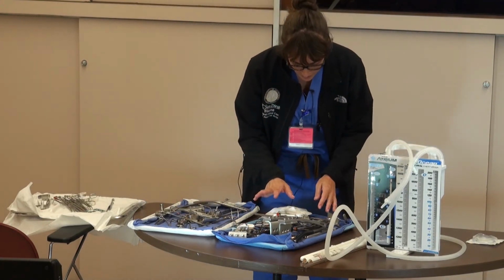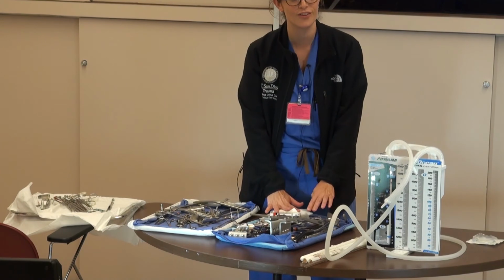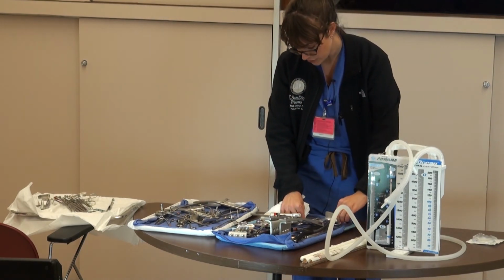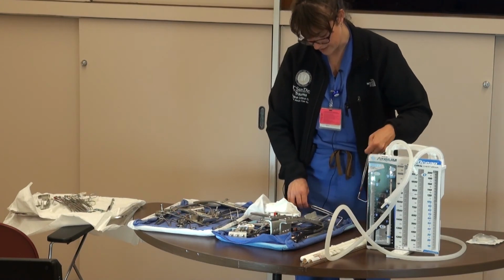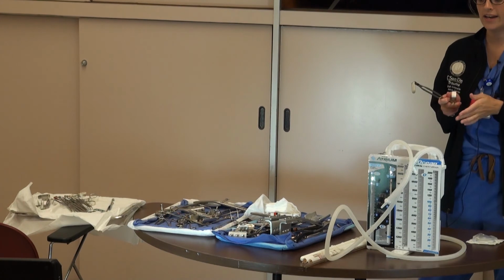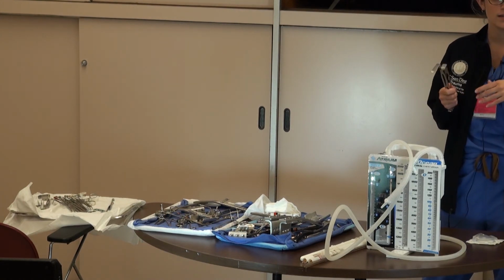So now I've looked at a few of these chest trays, and it's on all of them, so we can count on it being there. The other thing too is these Army Navies. So say there's a problem with the Finochietto. I have had cases where people couldn't get the Finochietto to work. We're still in an emergency.